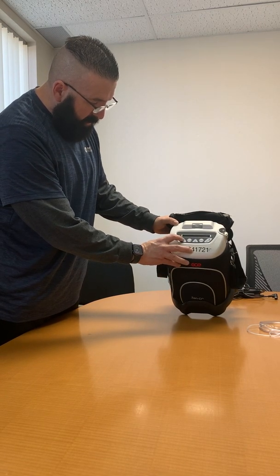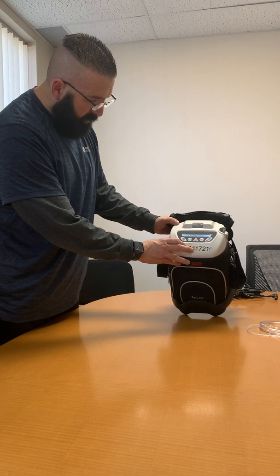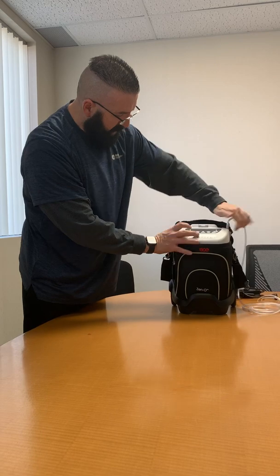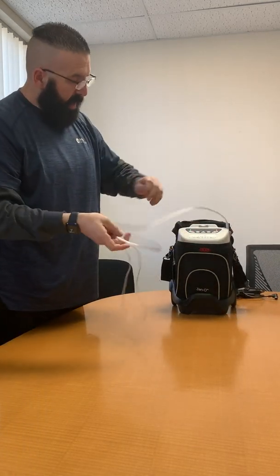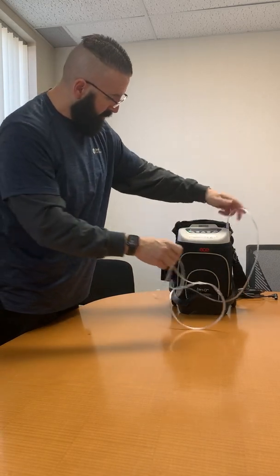Okay, back over here is your power off button. You'd shut that off when you want to shut the machine off. This is where you would connect up the cannula. It gets connected up to the side right here. The cannula obviously goes on the patient. I'd like for you to clean the tips of the cannula at least once per day.